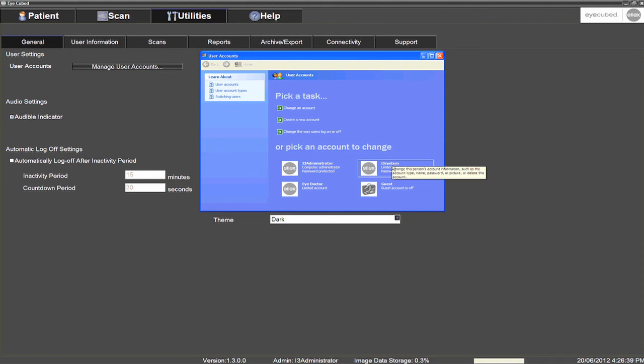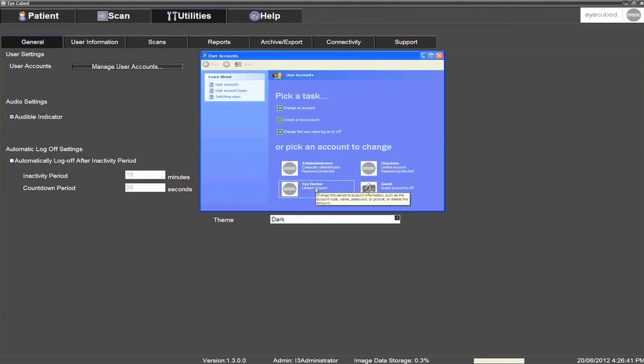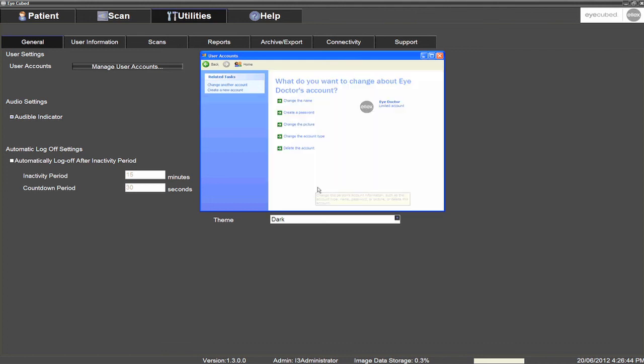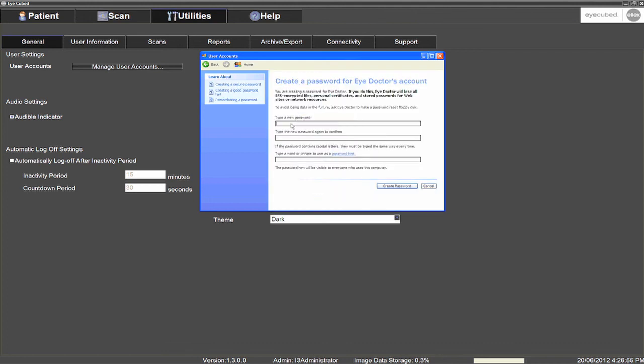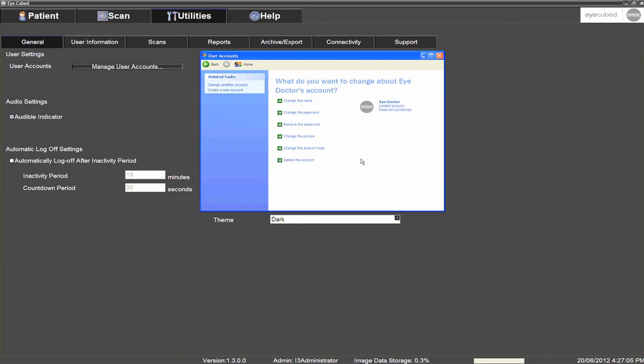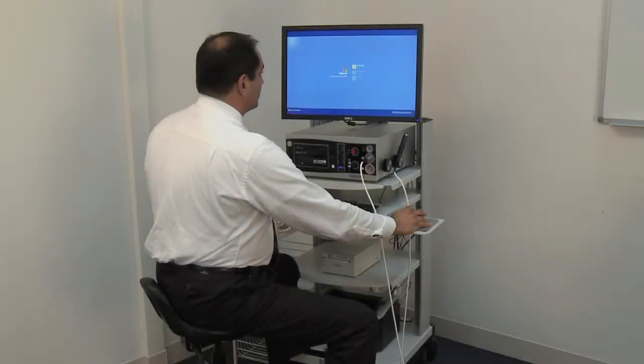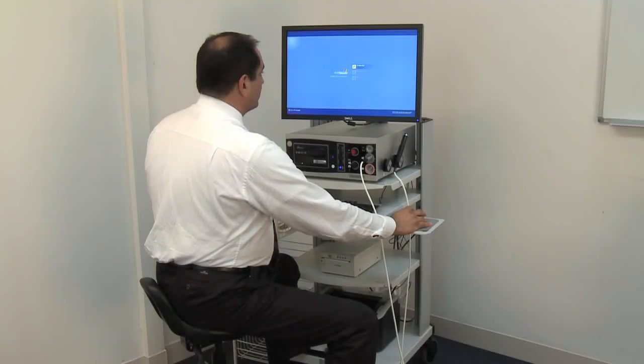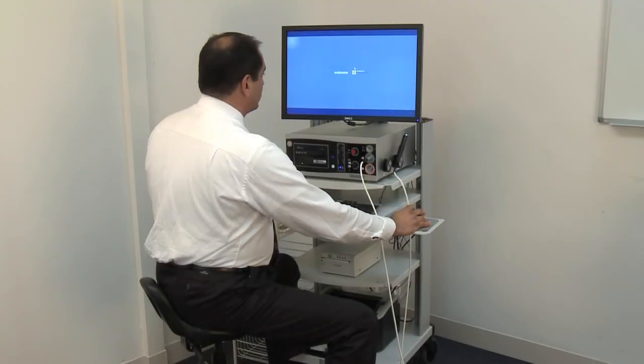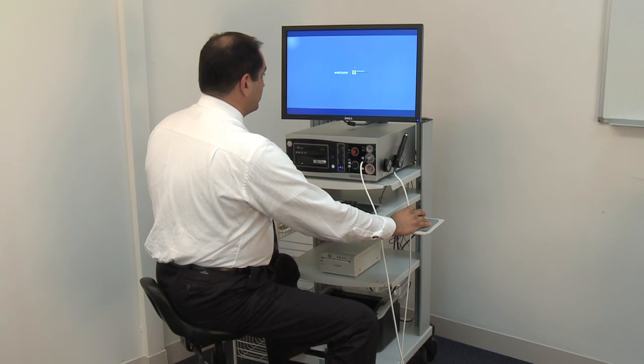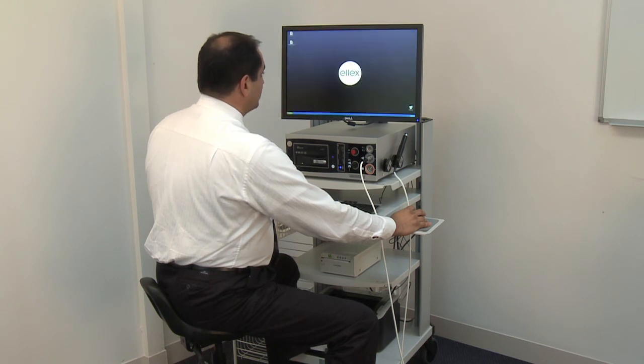You may wish to enter a password for this new account by selecting Change an Account, picking the account to change and selecting Create a Password. You may then click the white cross on the top right section of the screen to return to the user session interface. Enter the iCubed application again, but this time using the newly created user account. You are ready to start examining a patient.